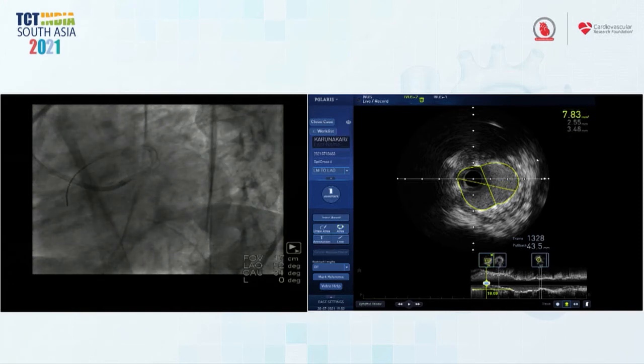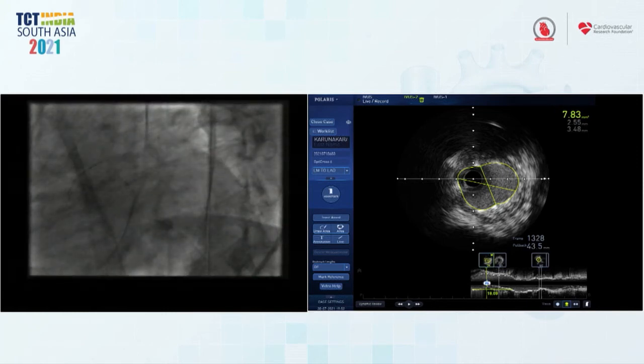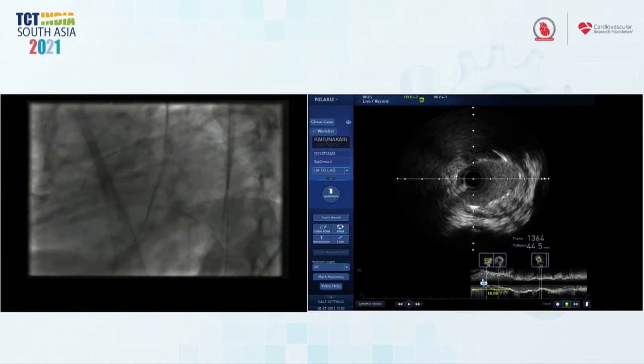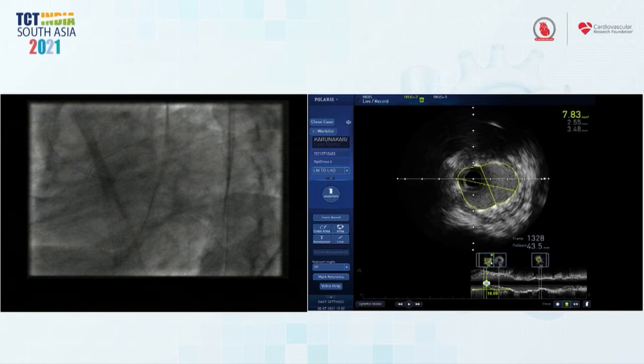You can actually see in this view a very nice example of the proximal optimization technique, as the stent is large just up until the circumflex. So that's very important to do a POT to your circumflex as part of the provisional technique here. If you don't have time, we'll click off, but I'm going to do a final IVUS, Ziad and Mustafa and Kevin. If you have time, then I can show that to you quickly.